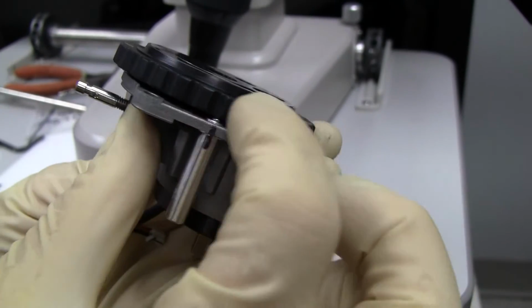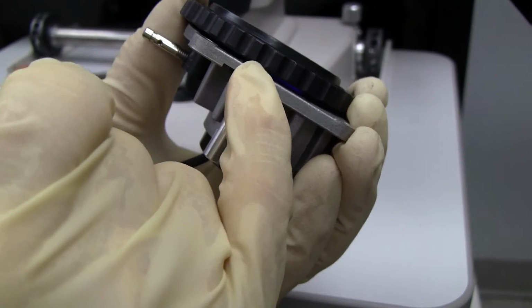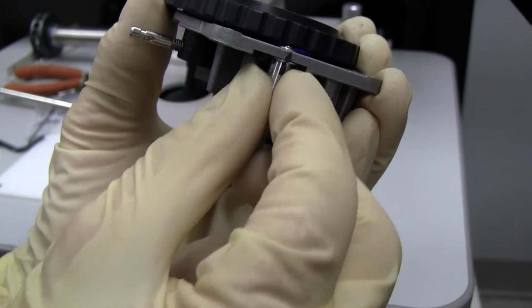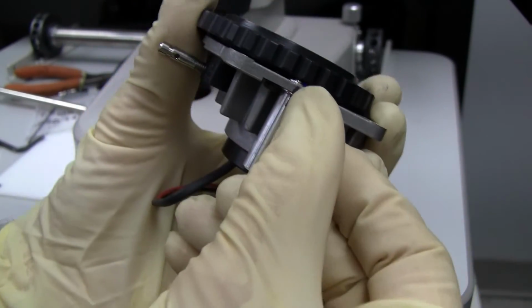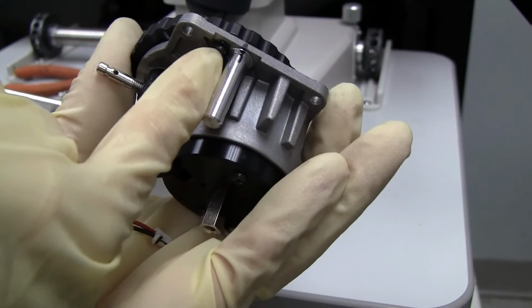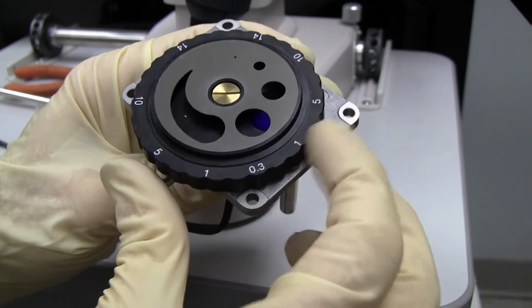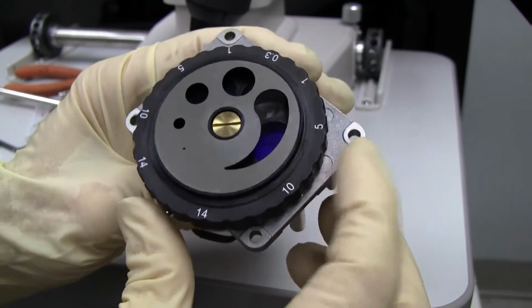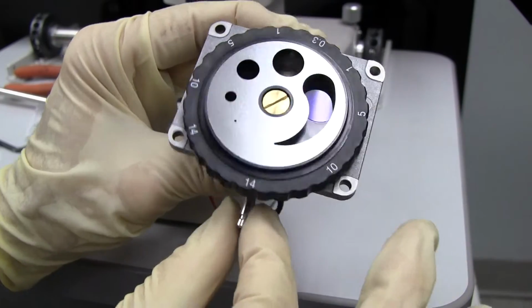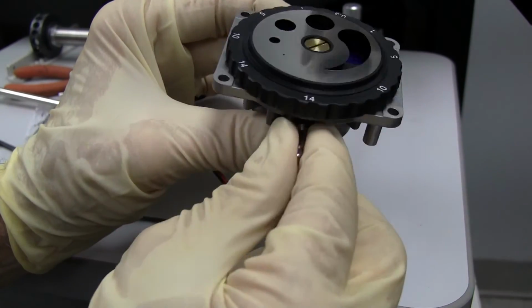What I did was turn the diaphragm wheel to where there was a detent, and then the bearing would naturally fit in there while I pushed in this holder in here. And then because I had marked earlier where it was, I put it back in the same place and then tightened the screw. So now the diaphragm is detenting and the filter wheel is fairly close. But we'll have to tweak it once we get it all put back together and according to the cover.